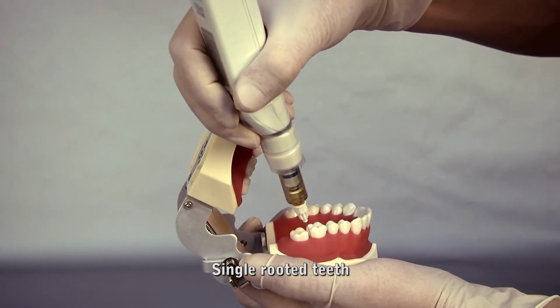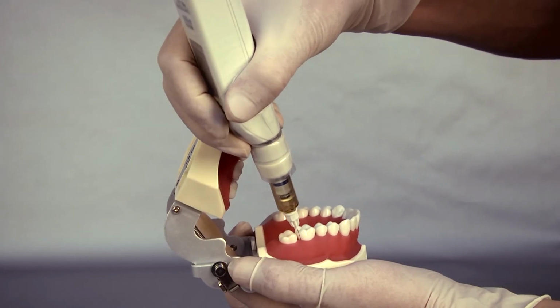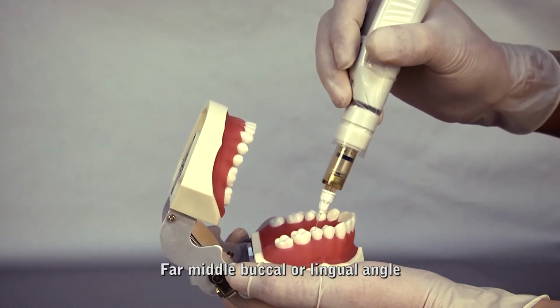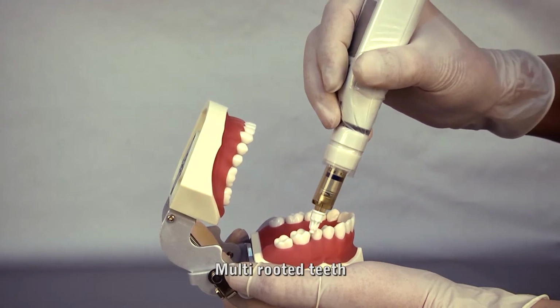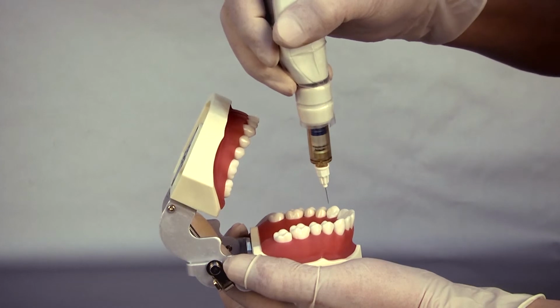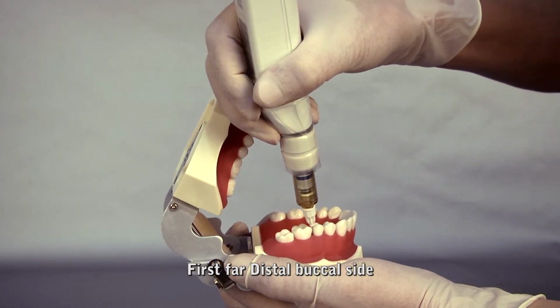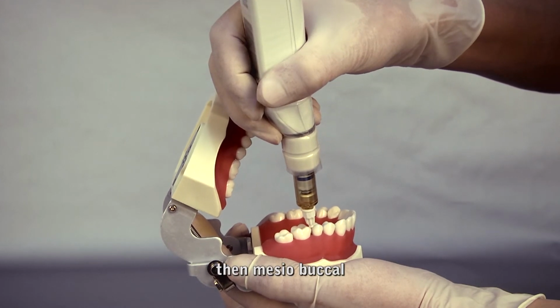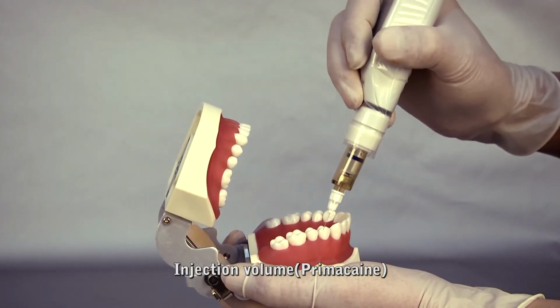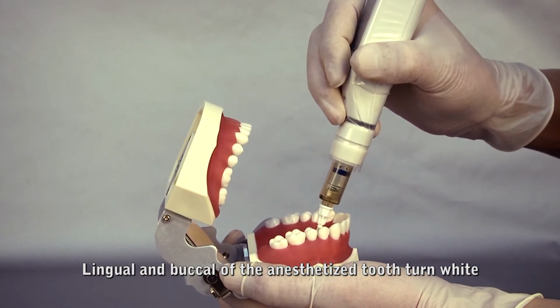Single-rooted teeth: injection once. Entry needle point: far middle buccal or lingual angle. Multi-rooted teeth: injected twice. Entry needle point: first far distal buccal site, then mesial buccal. Injection volume: until the lingual and buccal of the anesthetized tooth turn white.